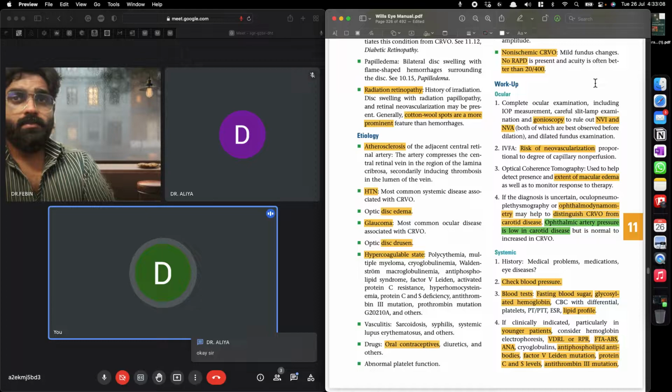After doing this IVFA, have I ever taken an OCT class for you guys? Did we do an OCT workshop so far? Okay, no. So an OCT is also extremely important for an RVO. I don't know if you guys have ever seen a CRVO OCT, but it is a very classic presentation. The main thing is it will have an IRF and it will have huge outer retinal tubulations. Okay, these two classic findings are there in OCT of CRVO. So you would also look for that.